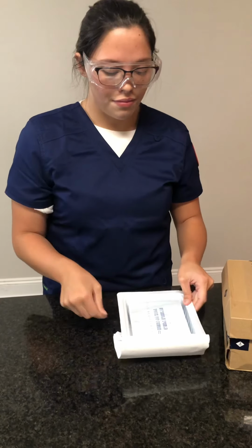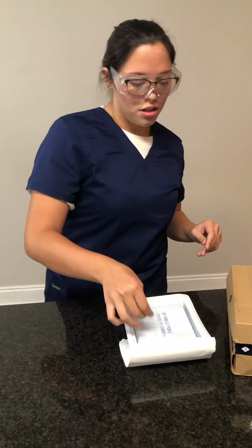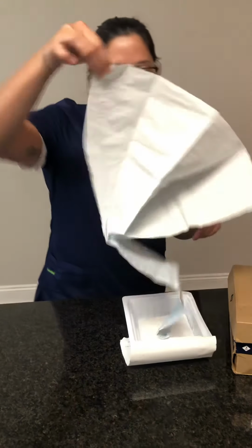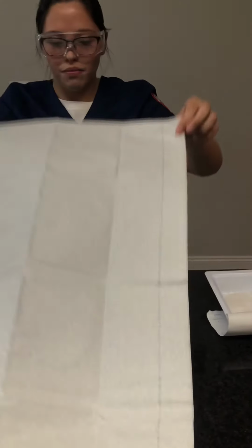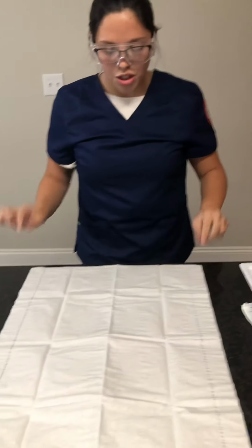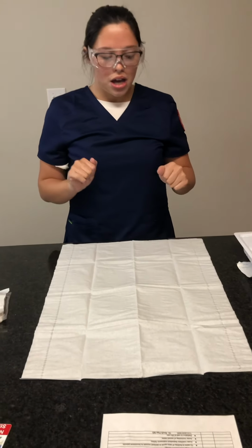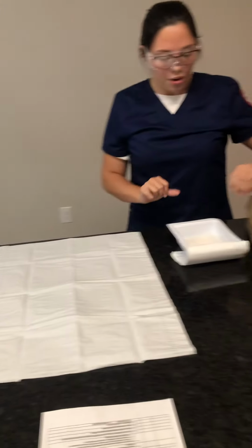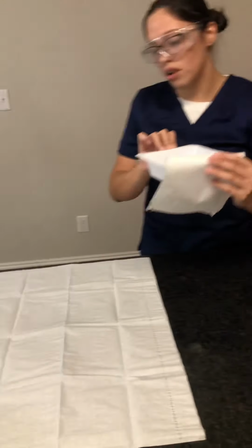I will then perform my sterile field. I will grab my sterile field. The 1-inch border is contaminated, and anything hanging off is contaminated as well. I will then dump the new packaging on the center of the sterile field.